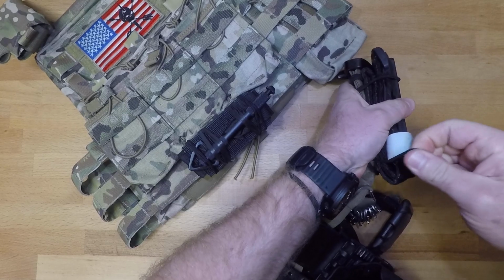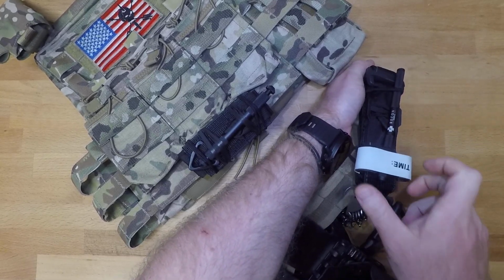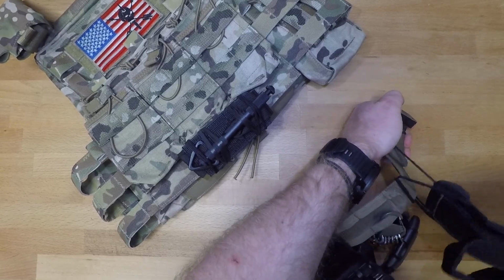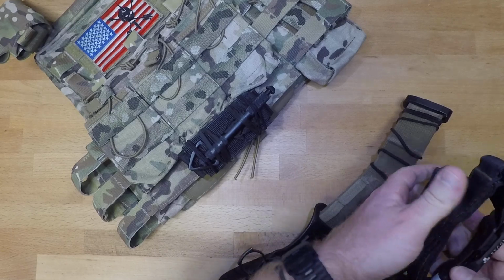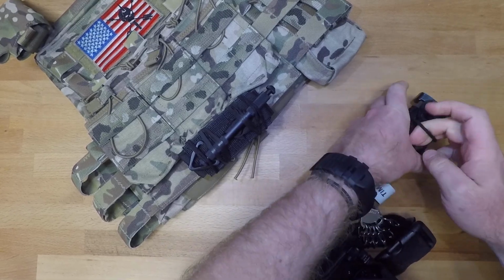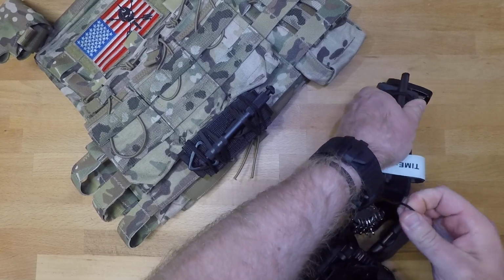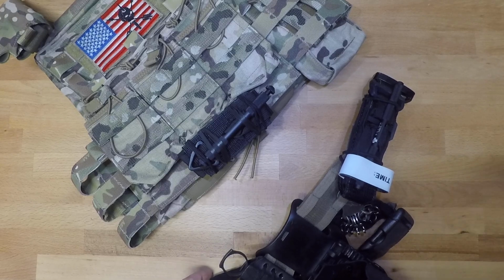If you want, you can actually just pull it from one side. You can grab the side with your time stamp and Velcro section and just pull it out that way. It will get caught up a little bit. You just got to put your finger in there, and then it comes right out. Make sure you're pre-staging your tourniquets, so that way if you need to pull these, they're already set up to where you open it up, and then you can apply it to both your leg or your arm.